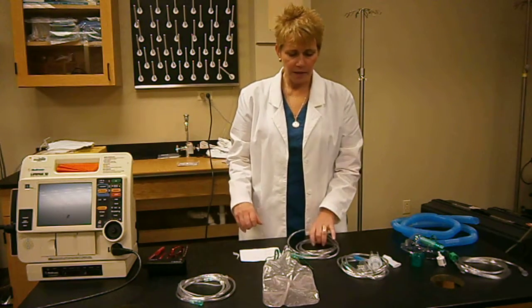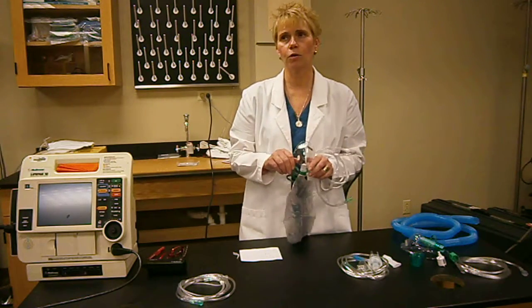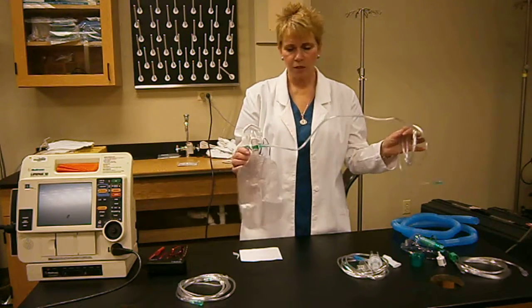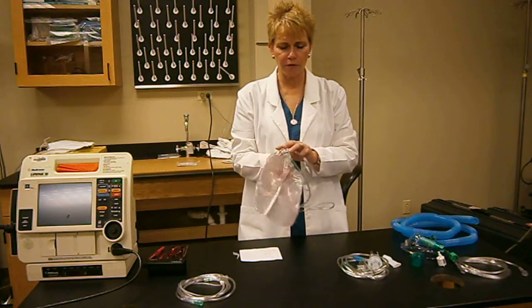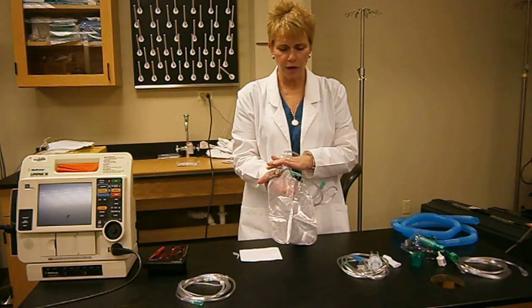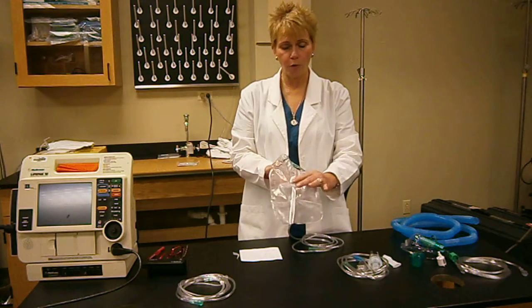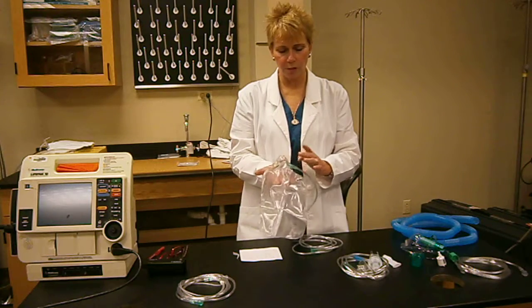The next one that you may be familiar with, particularly when patients are decompensating, we'll put our patients on a non-rebreather, which I have here. You hook it up to the wall. You can hook it up to 10, 12, 15 liters. When you do hook it up, you want the bag to inflate at least halfway, but not all the way. It doesn't have to be fully inflated, and then you apply this to the patient.